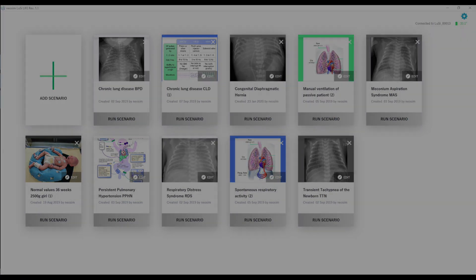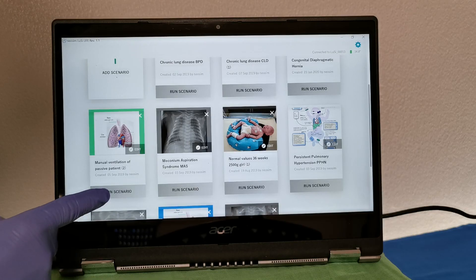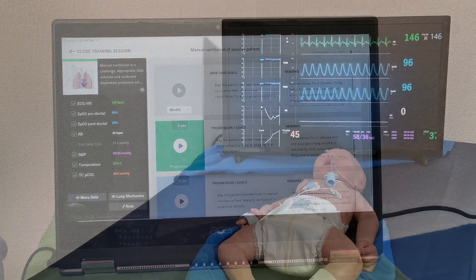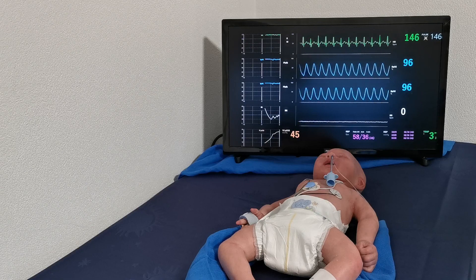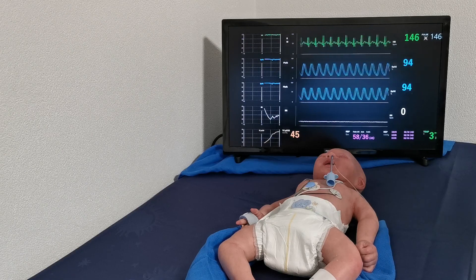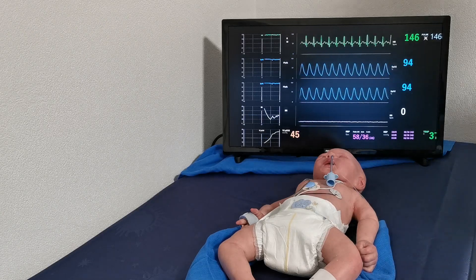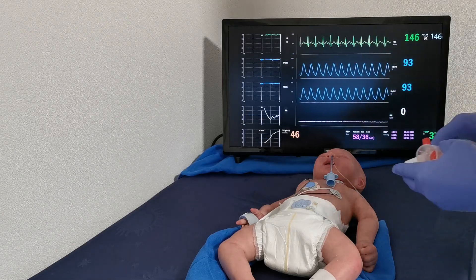Let's look at an example: sudden apnea. The trainer simply clicks on the run scenario button to initiate apnea and the software sends the scenario wirelessly to LUCI, which stops breathing. You can see that there is no chest movement anymore and the vitals start to drop.